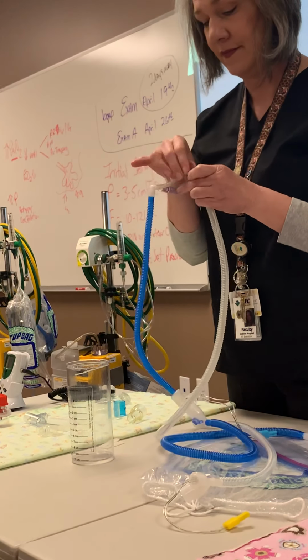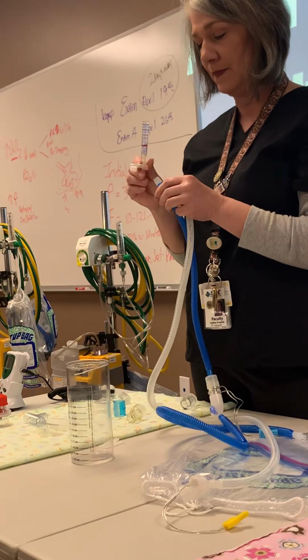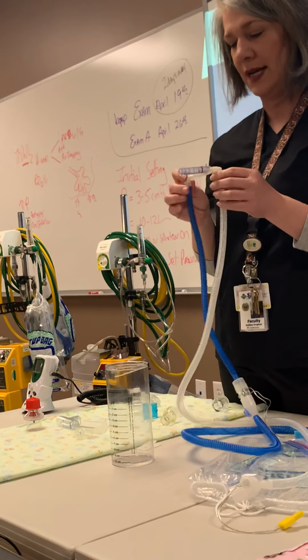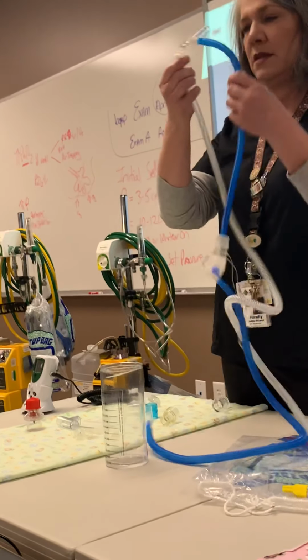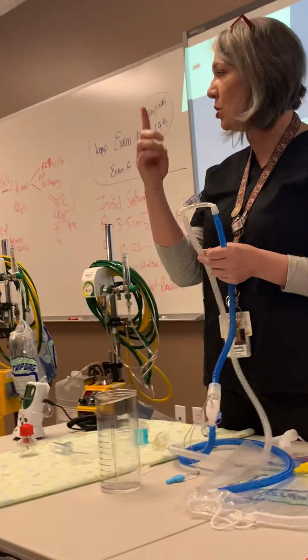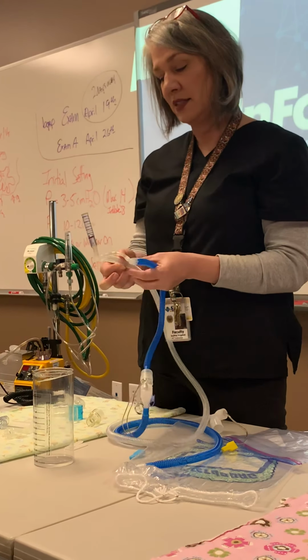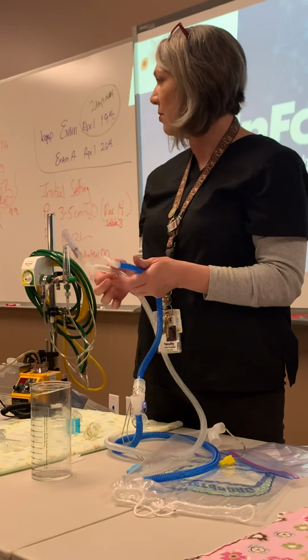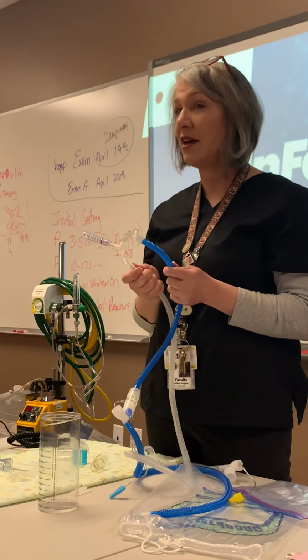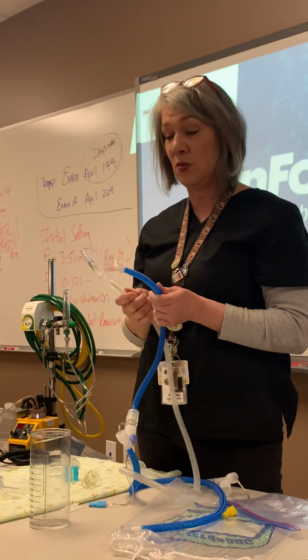There's like a special CPAP hat. It comes with the nares prongs. Sorry, I had to think about that for a second because I didn't have one with me. Most of them look just like the exact beanies that all babies get. They're pink and blue striped, and they just pin the tubing to the side of the nares. Some of the bonnets have little Velcro tabs that will then hold the prongs in. Sometimes we use tape. This is not a highly complex or technical maneuver. It's whatever works to make sure your prongs are stable.